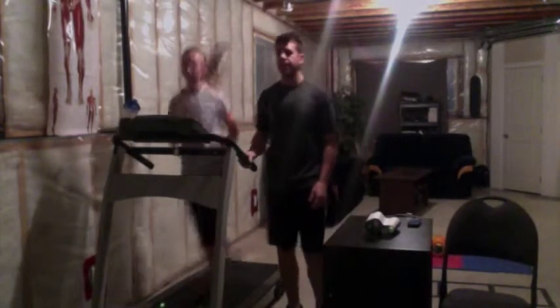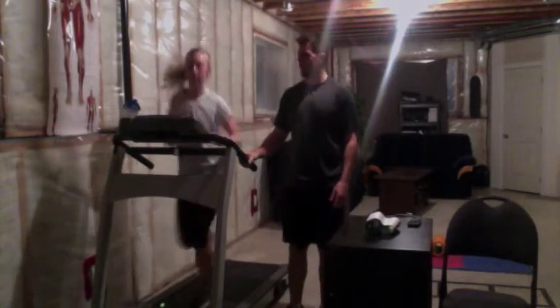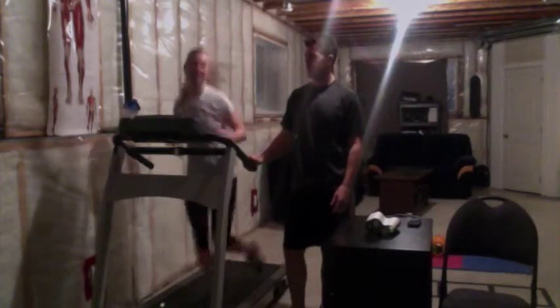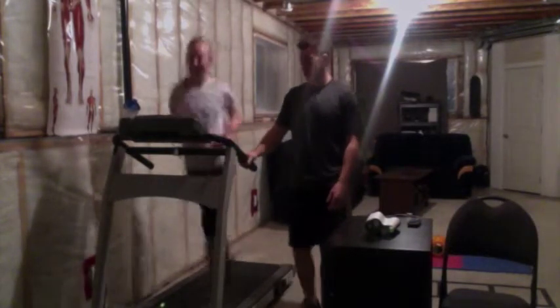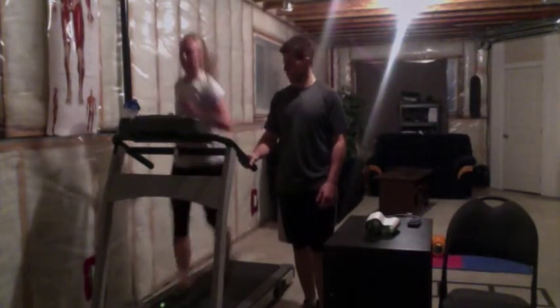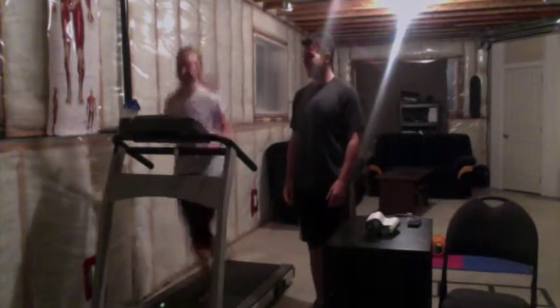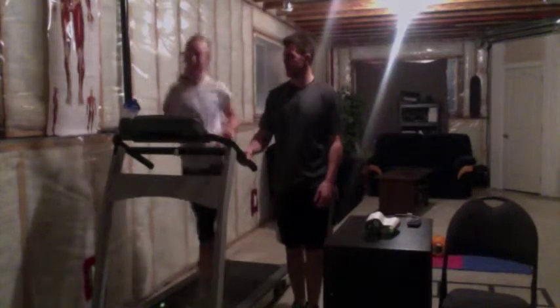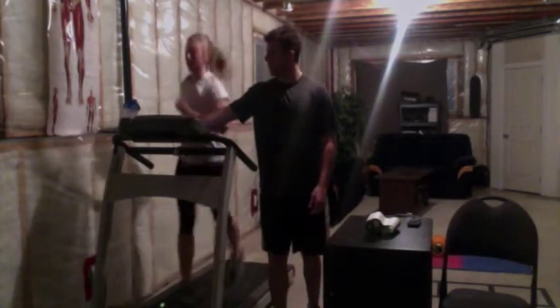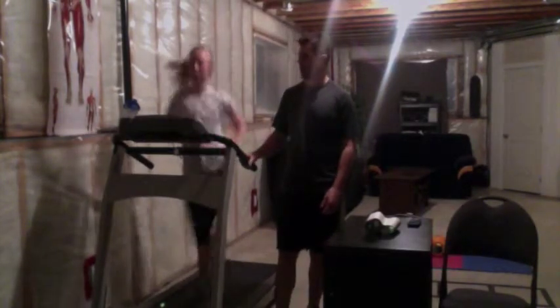Okay, here we are. We're coming up on the end of the 3 minutes below the AT level. Kaylee's hovering at 150 BPM, right where we want her. How's that RPE? 13. 13. Okay, perfect. Just below that AT RPE of 14. Your form looks good. How are you feeling? Tired. Tired? Okay. But still feeling strong enough to continue? Oh, yeah. Okay, so we're going to speed things back up to 6.5 miles per hour. And we're going to do another 3-minute stint above the anaerobic threshold.